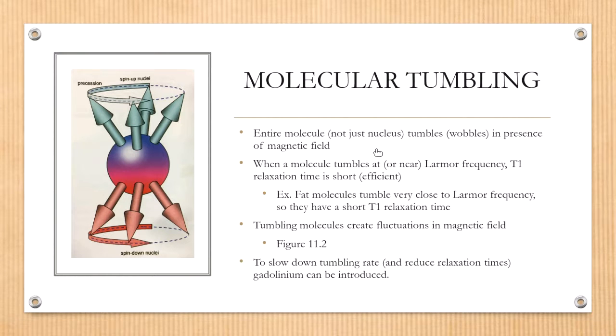Just like if a patient had a metal implant, that metal implant would influence the magnetic field and alter it in some way. Well, gadolinium in specific doses will do that in a way that doesn't create an artifact on the image, but rather, if it does create an artifact, it's really just brightening the signal of the water molecules. So gadolinium alters the magnetic field, which in turn alters the speed of tumbling of the molecules of water. As they are slowed down, they are now able to produce a signal in T1 weighted images.